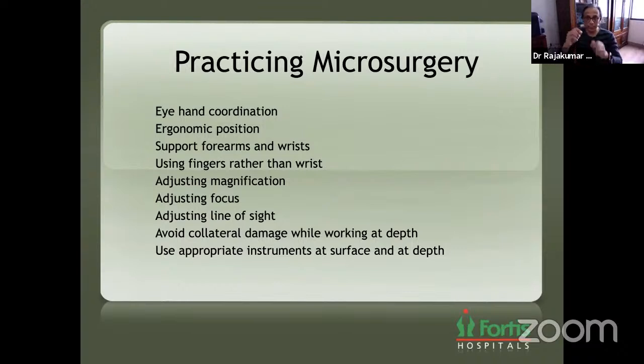Whereas in microsurgery, wrist movement should be minimal and finger movements should come into play. So it is more like using the fingers, especially the first three, not too much at the wrist, but rotating at the fingers itself. So that gives a better control.